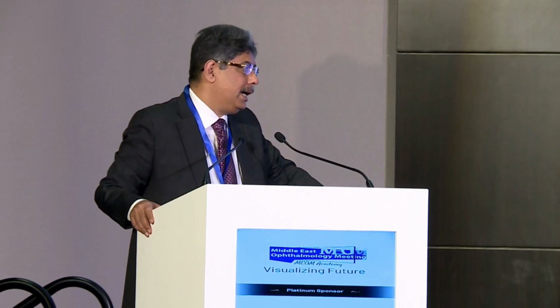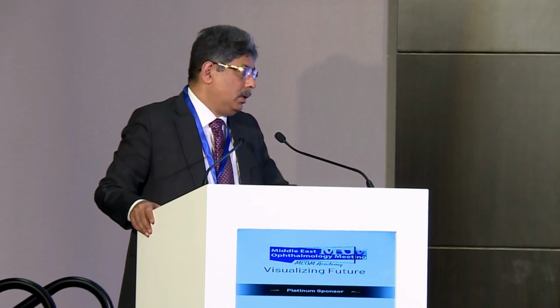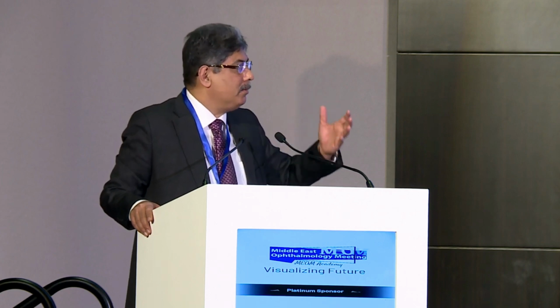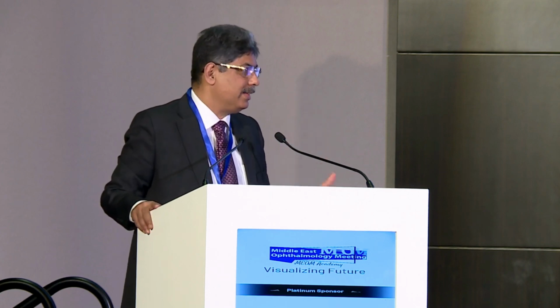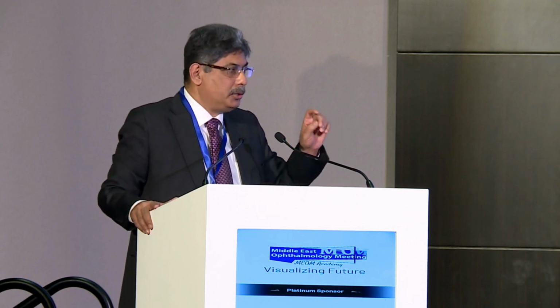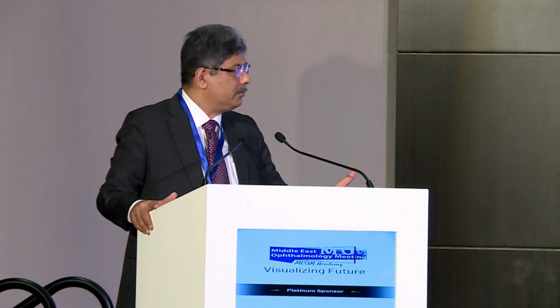I don't use the Kenacort. Kenacort is required not in all cases, but once you are not sure that the vitreous is totally removed, then you try to stain with Kenacort. So you are using Kenacort in whatever situations you think you need to. Ashraf and I were not using Kenacort alone.